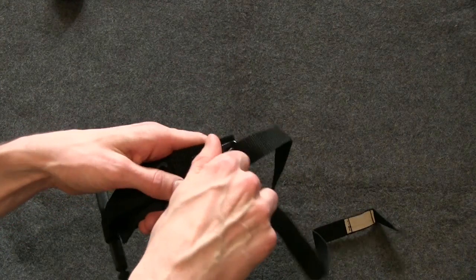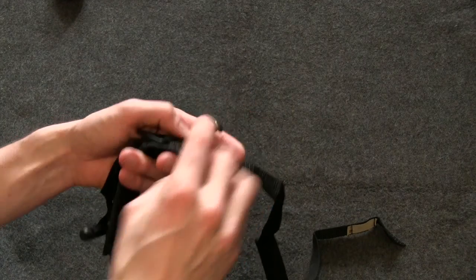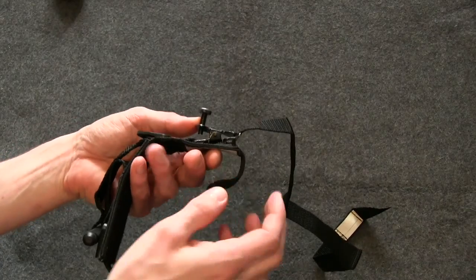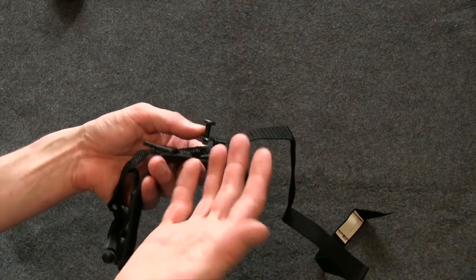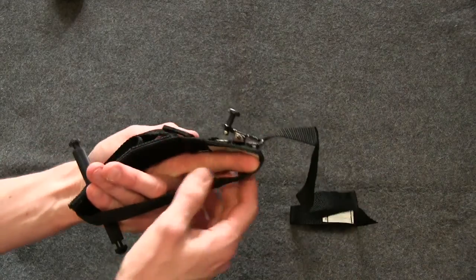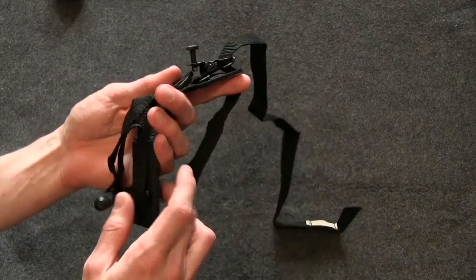Of course, even if you would take off this screw, this would work and would tighten. So this is only a safety measure, so you don't accidentally release it by applying pressure here. So quite a simple design, and I would say quite easy to use.